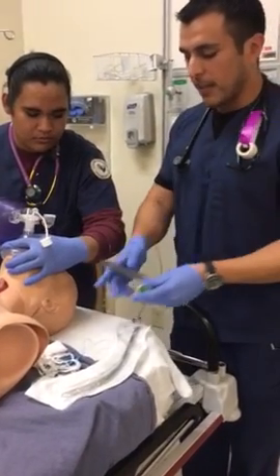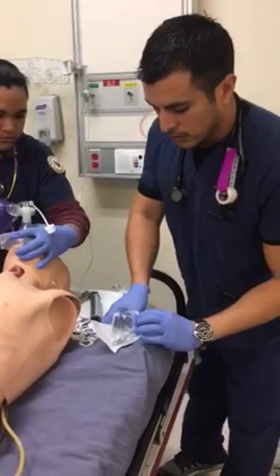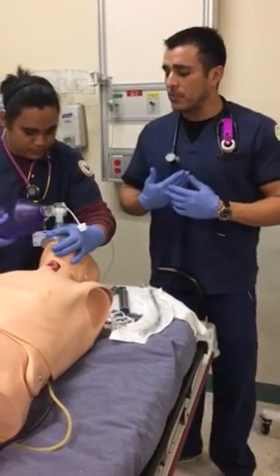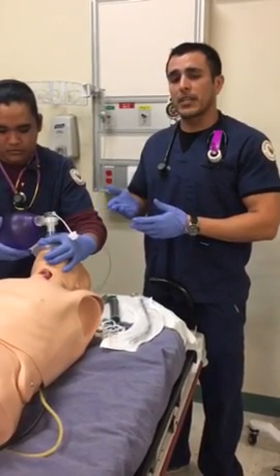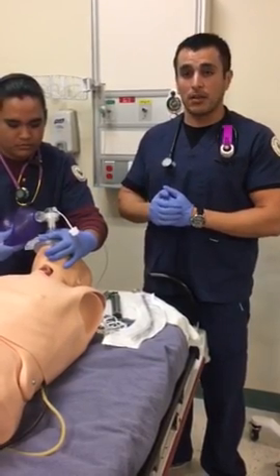Right now I would again do another check. I would check to make sure my light source is ready. I would lube up my cuff, my tube, so that it's easier to get into the patient's throat. When I take my attempt, I'm not going to want to take any longer than 30 seconds. So I will count down with my partner and let him know when I'm going to go. And if it takes any longer than 30 seconds, I'm going to come back out and he's going to hyperoxygenate all over again.